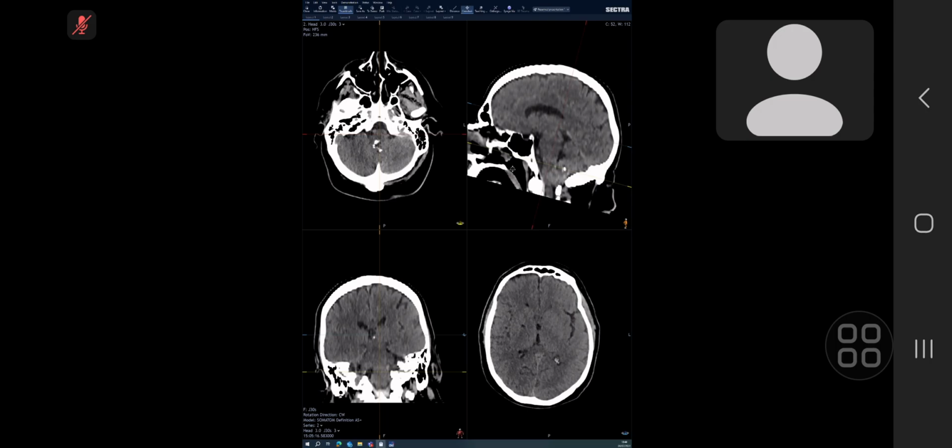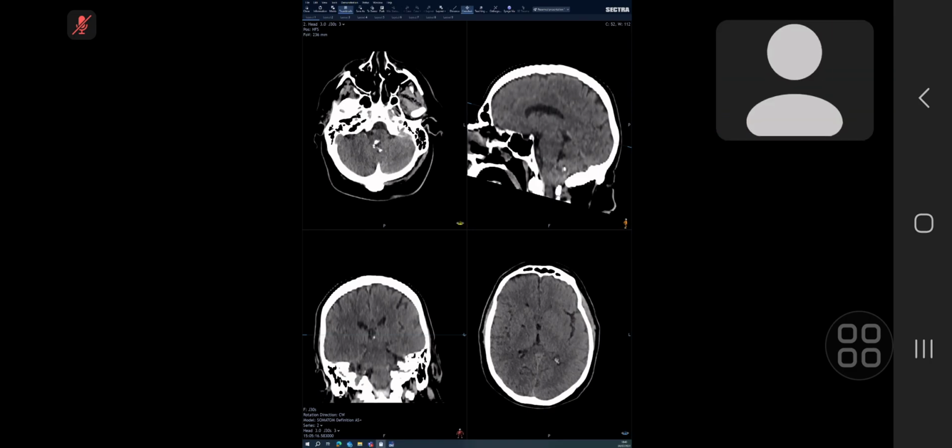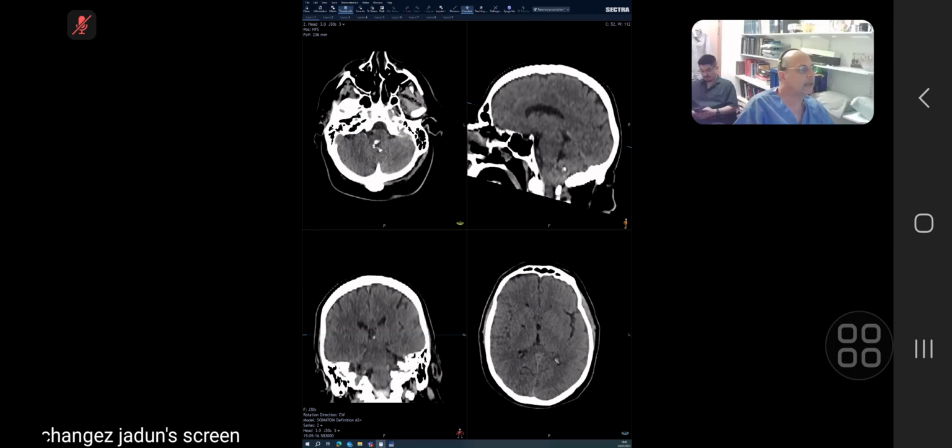So, can I know the age of the patient? The patient is, what do you think? In exam, the images are anonymized. So what do you think the age is from looking at the scans? Looking at the three scans, I feel the patient is middle aged. Yeah, that's fine. Yeah, correct.